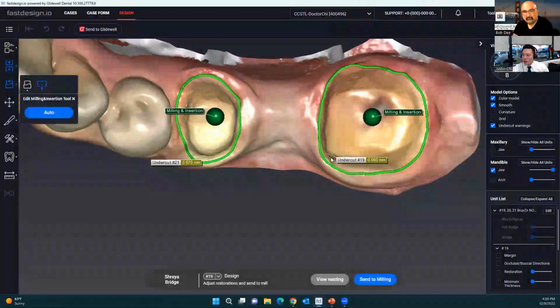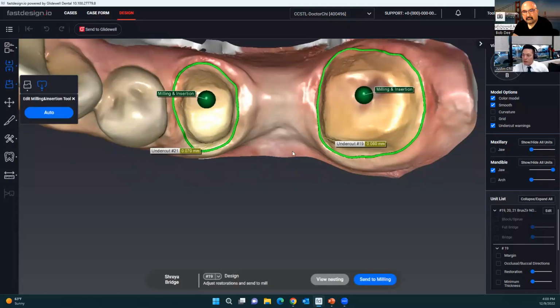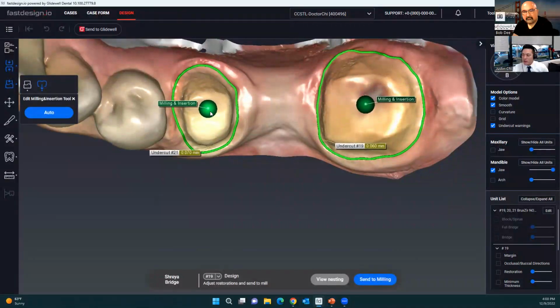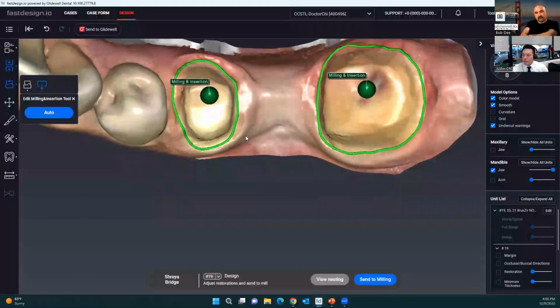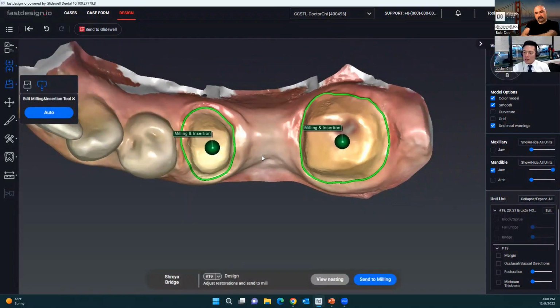And undercuts are not a huge problem as long as they're not really on the margin. So you can see it highlights the undercut based on the path of insertion. With a bridge, you want both abutment teeth to have the same path of insertion. You'll see that when I move this arrow here, they're linked together. And so you have the option maybe to move this arrow to see if you can eliminate the undercut. Just moving that slightly to the buccal did actually cut down on those undercut labels. You can see there's still a little bit of red, but as long as I don't see an undercut at the margin from this bird's eye view of the insertion direction, as long as I can visualize both margins, I'm ready to go.